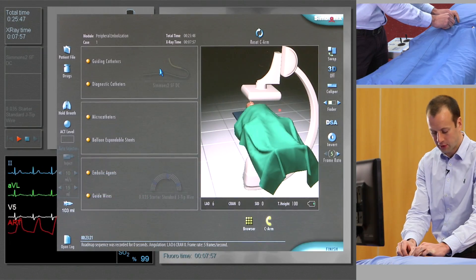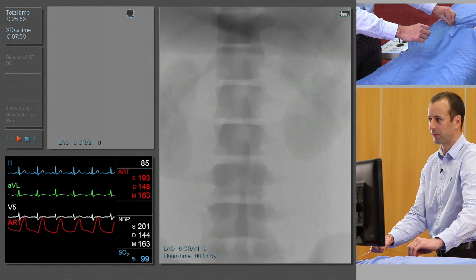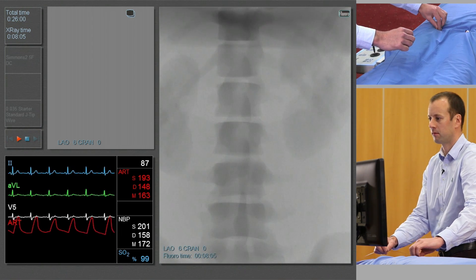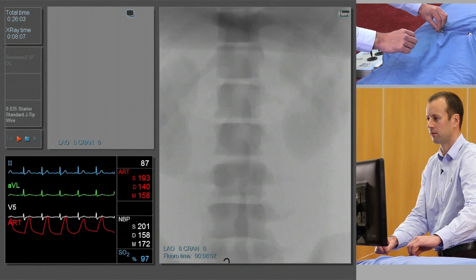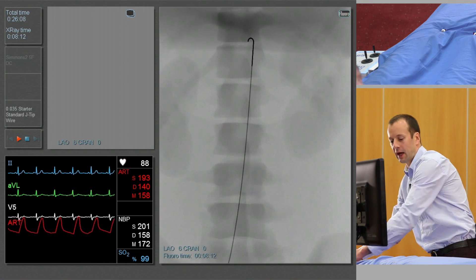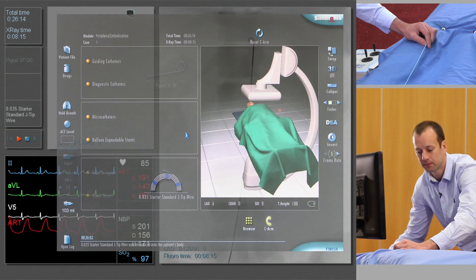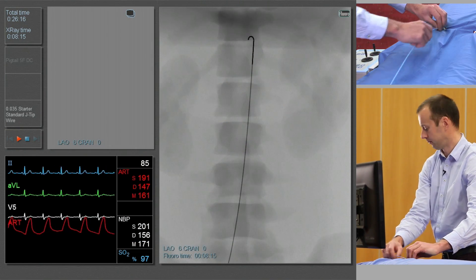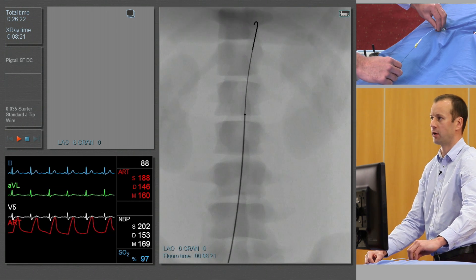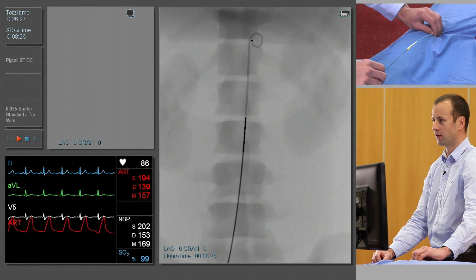We'll start as normal with a J-tipped guide wire, which we'll insert into the abdominal aorta. Over that, we're going to insert a catheter — this will be a pigtail diagnostic catheter. We'll use this to do a flush aortic angiogram to give us an idea of the levels and the configuration of the vessels.